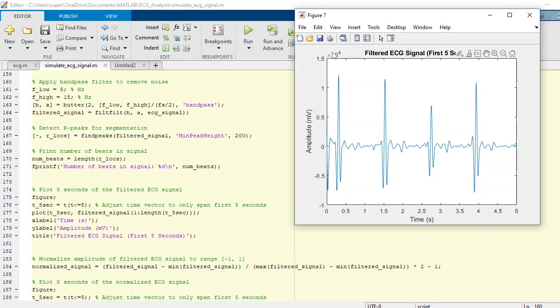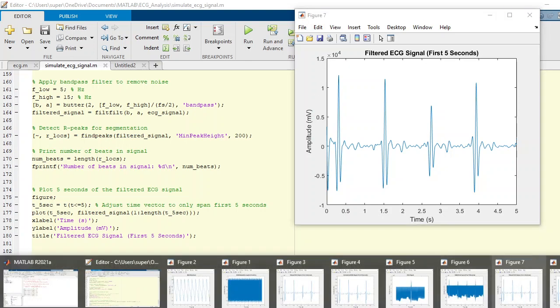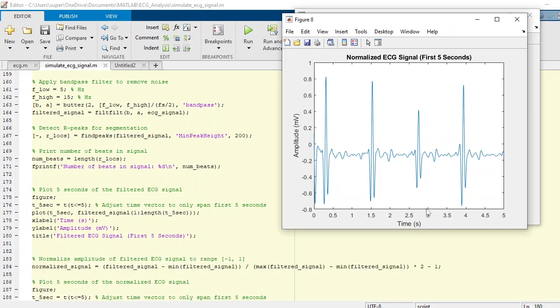After that, we need to normalize the data. What normalization does here, if you notice closely, the amplitude is not normalized. These are some ambiguous numbers here. If you normalize the amplitude, it would look like this. Here you will see that all the plotting is between minus one to one.